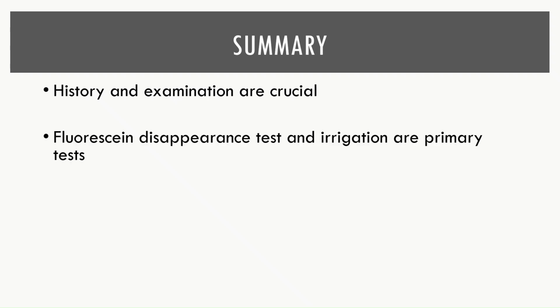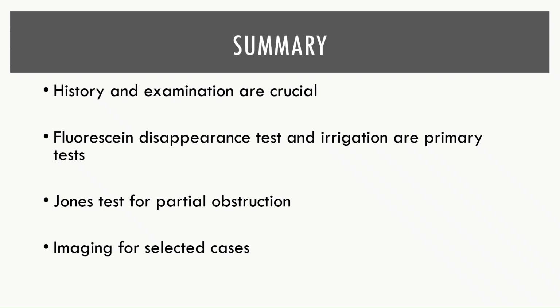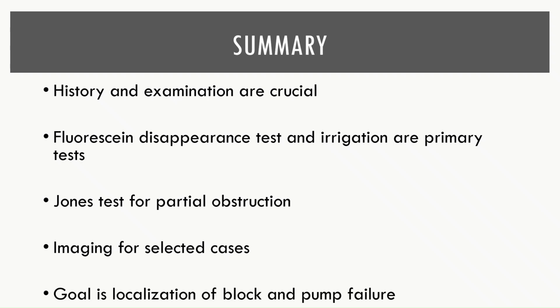In summary, evaluation of the lacrimal drainage system requires careful history, slit lamp examination, bedside tests such as the fluorescein disappearance test and irrigation, and imaging when required. The goal is to localize the site of obstruction and assess lacrimal pump function for appropriate management.